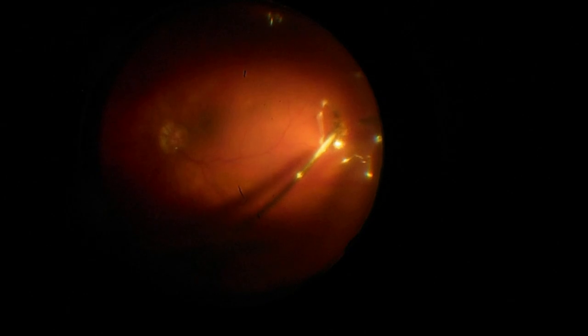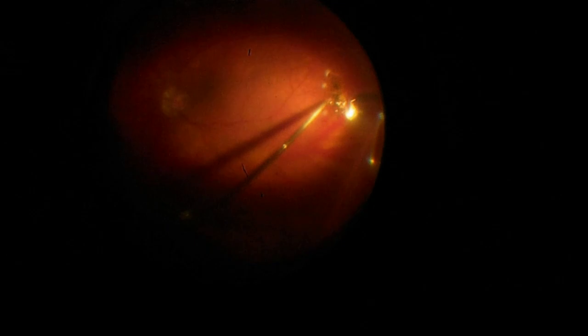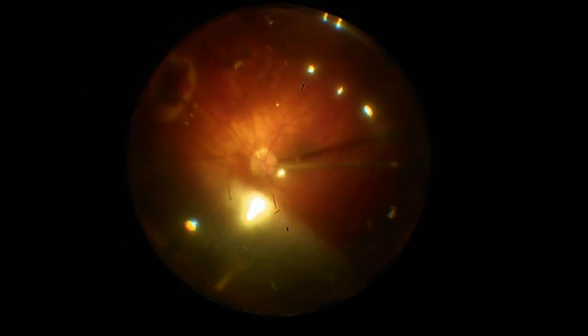If necessary, we could use perfluorocarbon liquid, but we wanted to avoid that in this case because the eye was quite large, making it more difficult to recover the perfluorocarbon at the end. We can also slightly orient the patient's head by turning it, although this is not always feasible, so we managed to perform a more or less satisfactory fluid-air exchange.